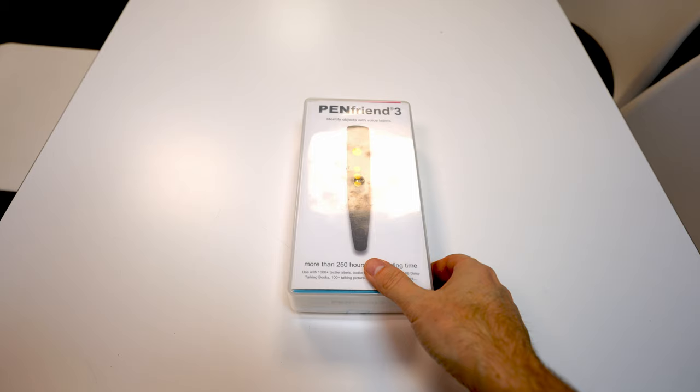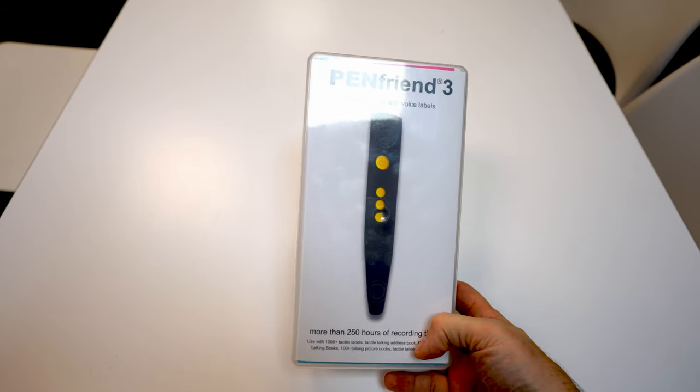Hey guys, it's Sam with The Blind Life. Today I am taking a look at one of the classics, one of the OGs. This is the Pen Friend, and specifically we're looking at the third generation Pen Friend.